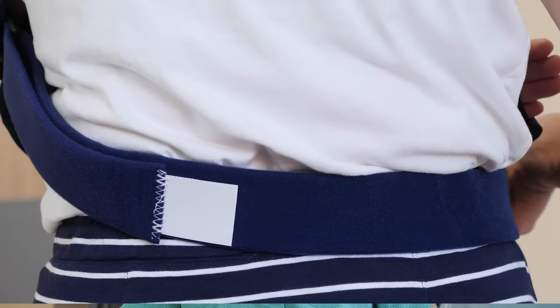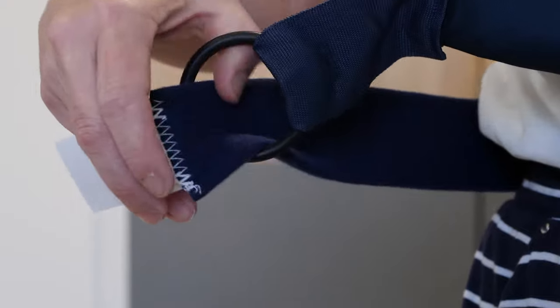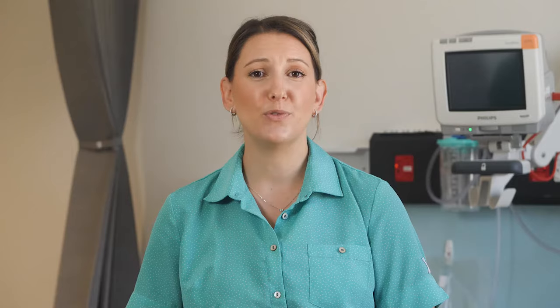Next, take the side strap behind you, pull it around your waist, under the good arm, through the side ring and secure with the velcro tab. The side strap prevents you from turning your arm outwards.